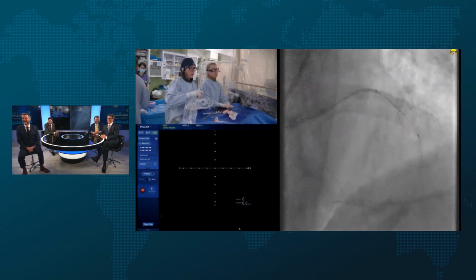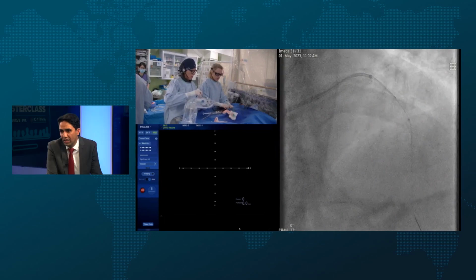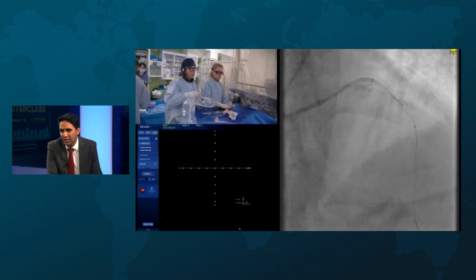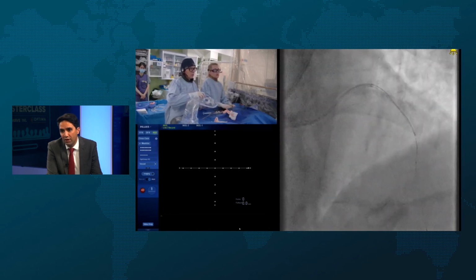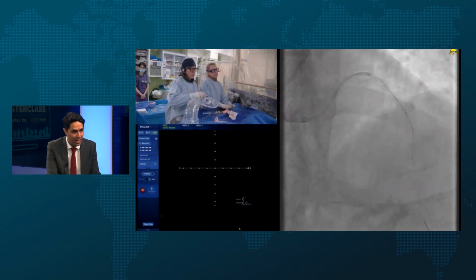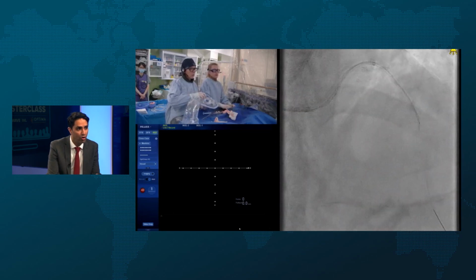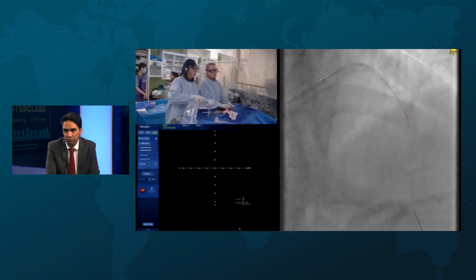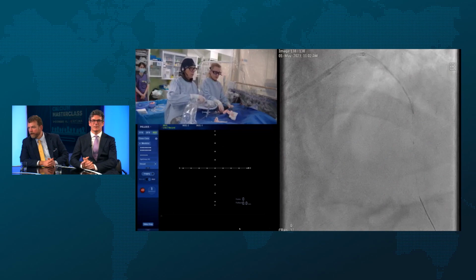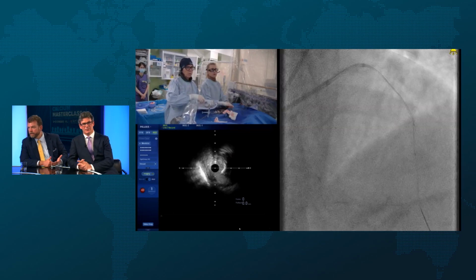So in the nodule on IVUS, what we should be looking for are two things. It's unlikely you fracture the middle of the nodule because it's just so thick. But often what happens is you break the interface between the nodule and the calcium on the sides, so you should see a shadow or a dark gap at the sides of the nodule. And we'll really be able to tell that on the post-stent IVUS run. That'll be the real telltale of what we actually did or didn't do.